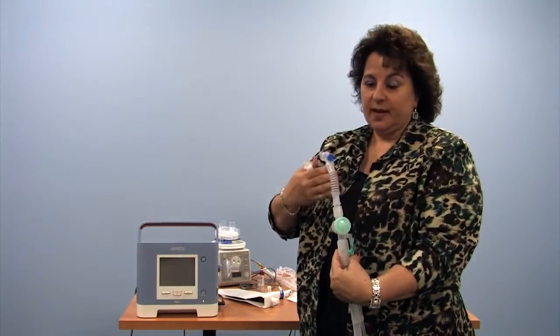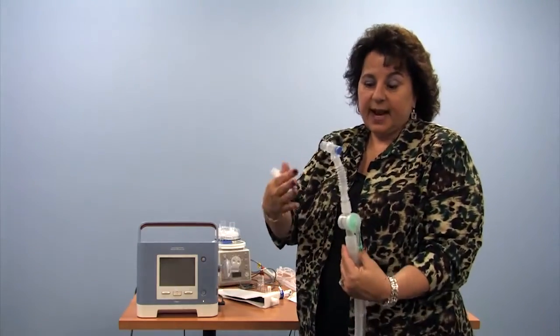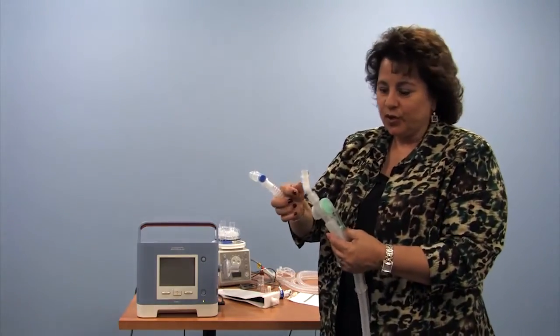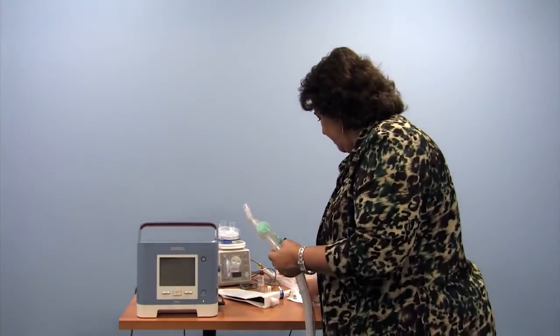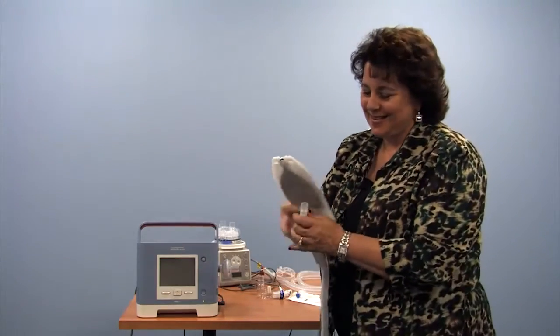Obviously, if this is connected here to my neck, I would like a longer piece. It would be easier for me to roll around on the floor if I were an infant if I had more flexibility. Unfortunately, we can't always provide that for your children. For the purpose of today, this is our child.